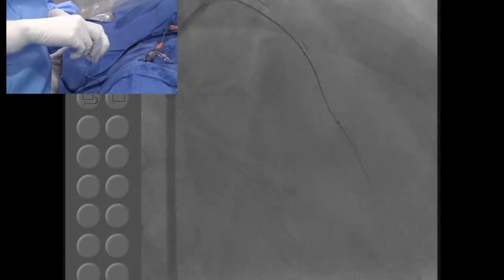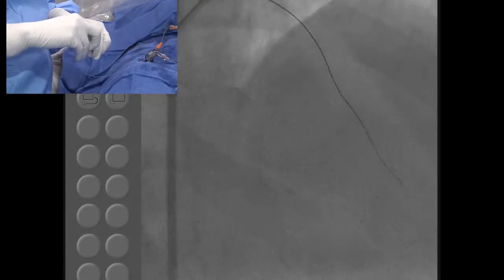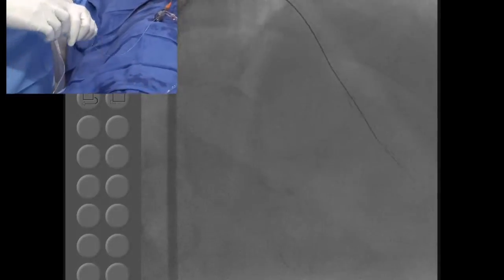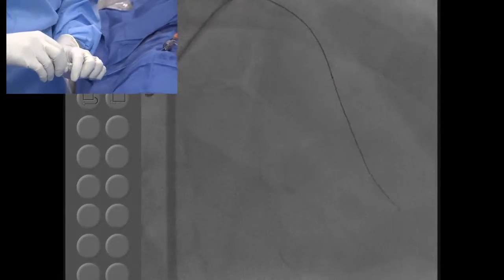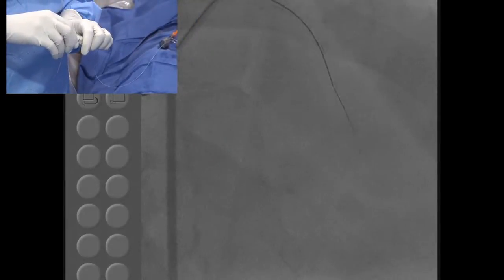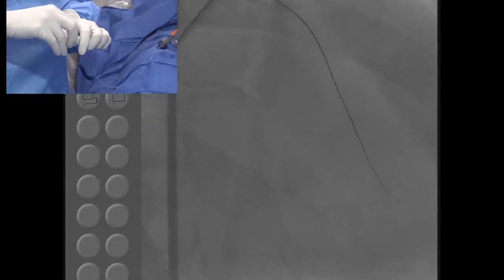One of the negative parts here is that. And also in this case, the length also, no? Yeah, definitely. The side branch originating, the bridge collateral, but length is still, I think, something we are able to counteract, but the calcium is the one major issue. And that's where actually many times the Progress wire works.